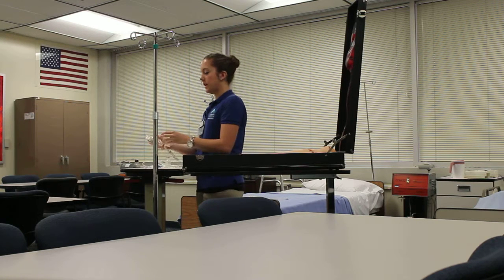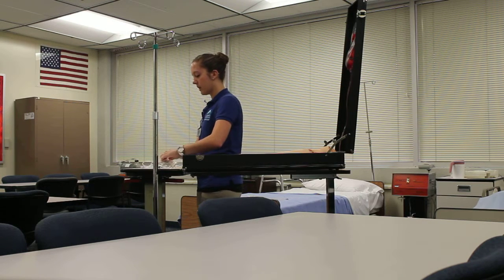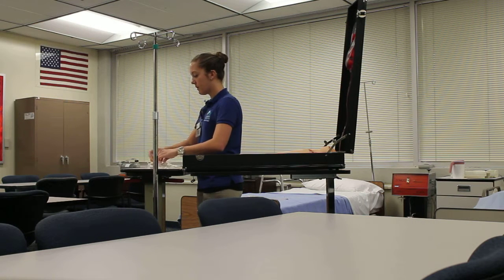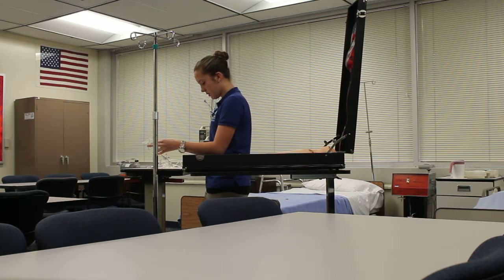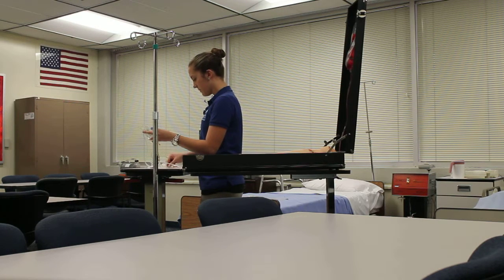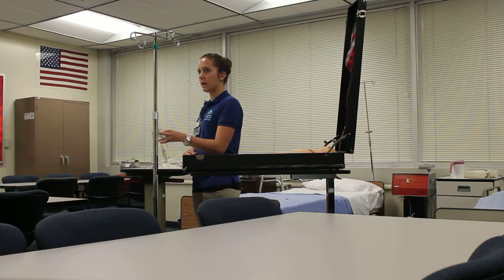I'm going to mix my medication. And I can go ahead and spike the bag. Make sure everything's clamped off. I want to go ahead and prime my tubing, so I'm going to unclamp it. Once I've done that, I can clamp it back off.